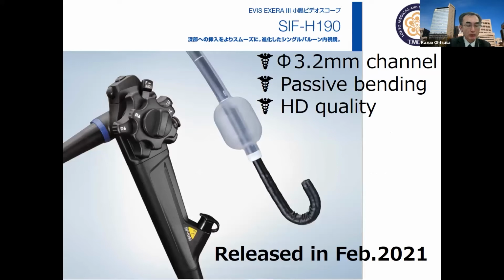Last February, a new single balloon endoscope was released. It has a 3.2 millimeter diameter channel. It helps smooth insertion of the catheter. It is equipped with passive bending. It will help insertion into the intestine with difficult anatomy, such as in Crohn's disease.